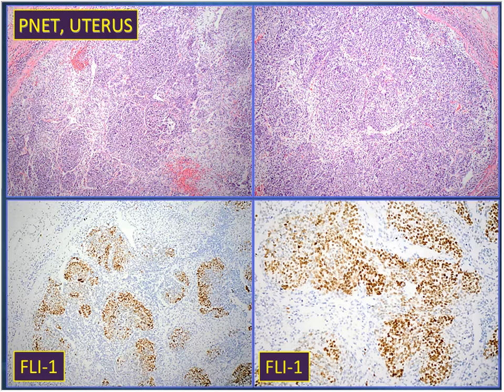Positivity for FLI1 confirmed that diagnostic impression, which was also confirmed by CD99, etc. Molecularly, of course, these can be easily confirmed by molecular techniques.